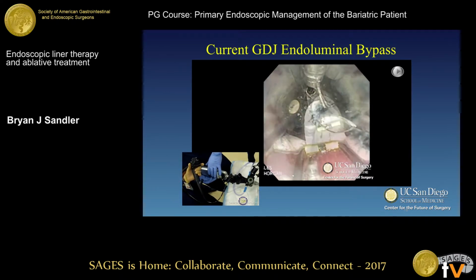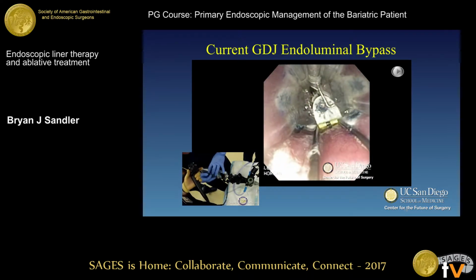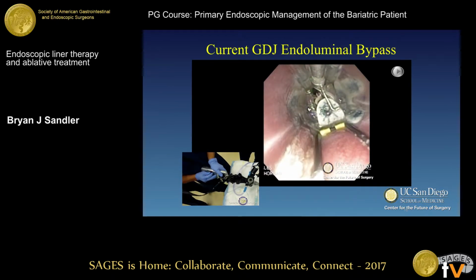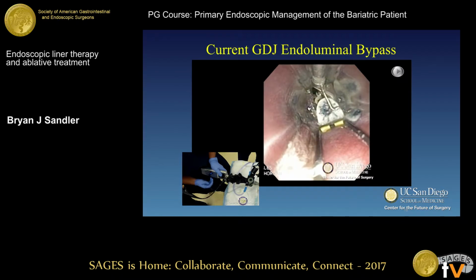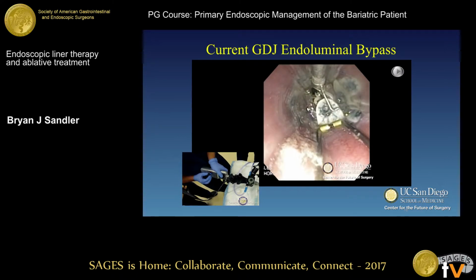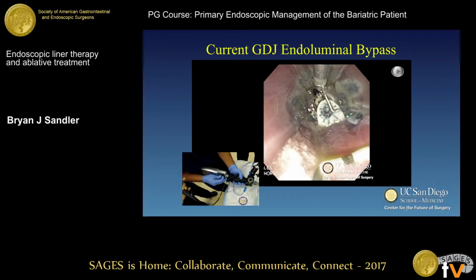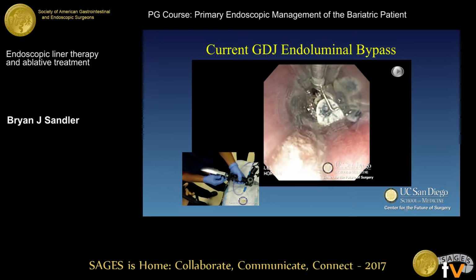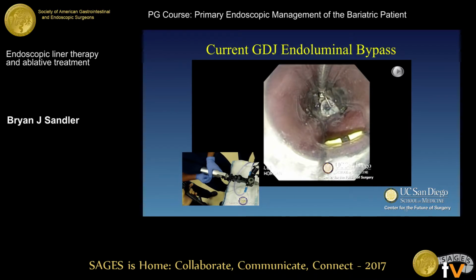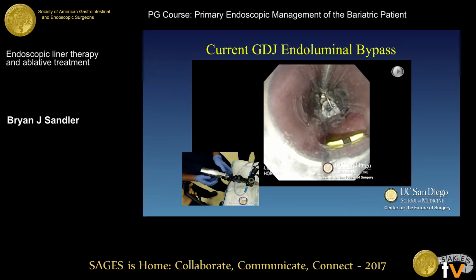challenges you see here. This is the previous generation of the device. Once we've got the tab captured and the needle in place, now you'll see we pull the scope back, pull back the guide, which is in the bottom right-hand corner of the screen, and then apply the vacuum. You'll see the screen blur and fire the stitch. So here we are, just about ready to apply vacuum.